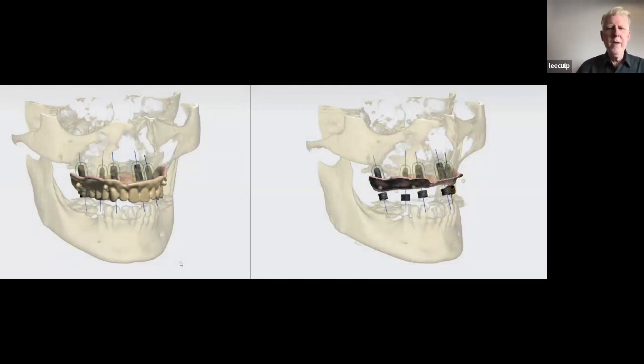So first, if we're doing edentulous and we're setting up implants and we've got a denture and we're going to do a double scan technique, the most important thing to remember, if we are going to put fiducial markers on a denture and do a double scan technique, is that you always need to put a wash liner in that denture.